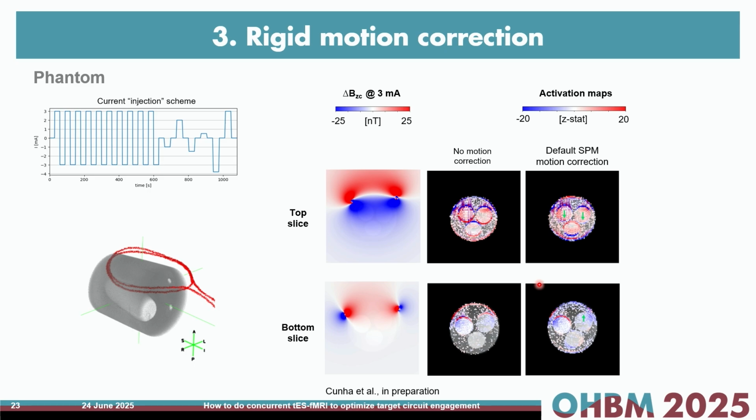So what the algorithm will do is try to rotate and shift the image around to best fit the two images, but it will not be very successful. So in some places, yes, it will manage to correct somehow, but in some others, it will induce or invert the direction of signal changes. And this creates artifacts that we cannot explain, are just unexpected.